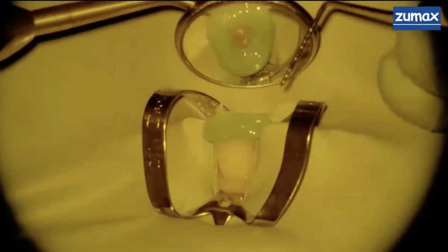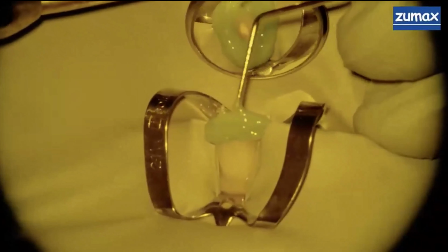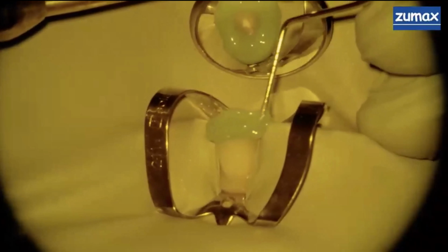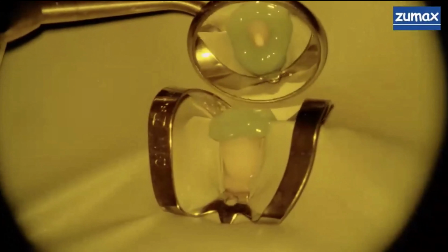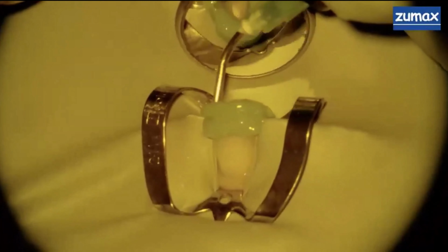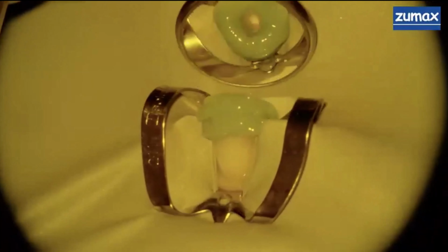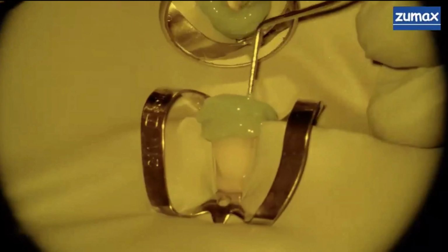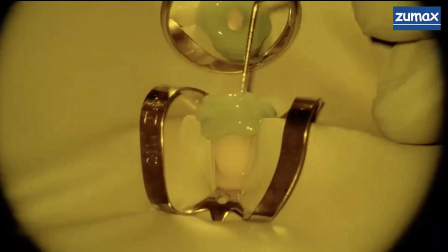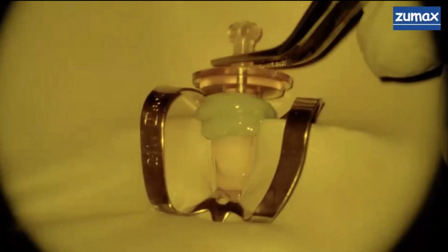I'll take the perio probe, I'll sculpt it, I'll make that channel nice and round, smooth, and then I'll polymerize. Now, you may notice on the buccal, I didn't go all the way down to the CEJ. You don't have to if there's no restoration there. It's much more important to do it on the back of the tooth, on the lingual aspect. I'm building up this little donut, creating that shape, extending the access, polymerization, testing to see if it seats.